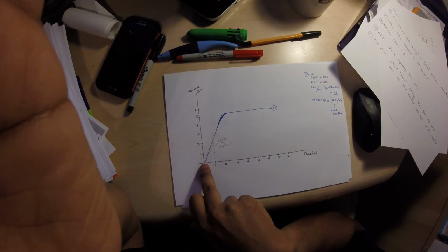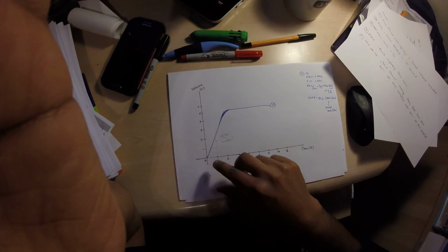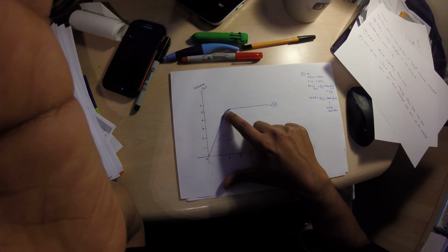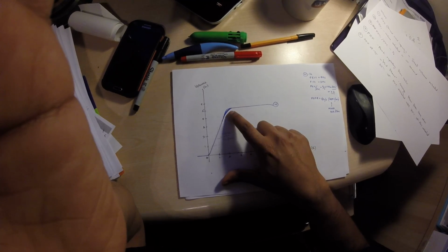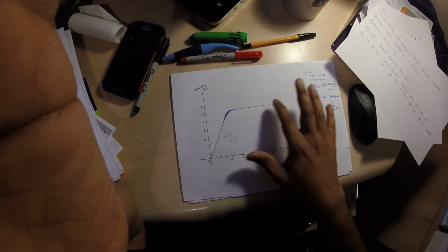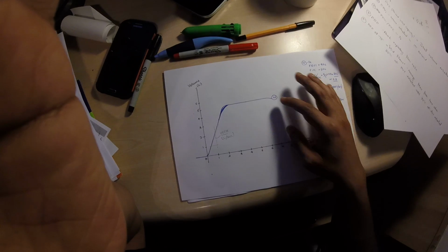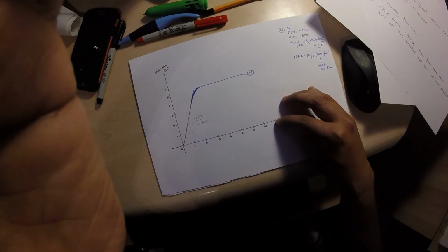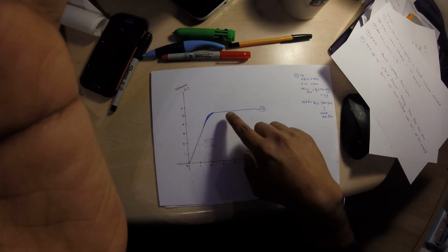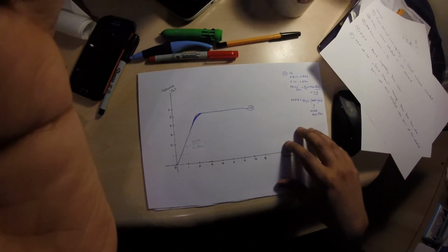So this is a deep inhalation, and as soon as you say go, the patient exhales as hard and fast as they can, and they go into their second, and then the flow tends to slow down, and then it plateaus out or has a slight incline, and usually gets to about 5 to 6 liters, and at about 6 seconds the curve either goes dramatically down and goes back to 0 because they'll be getting ready for an inhalation. So I'm describing it as a normal graph.